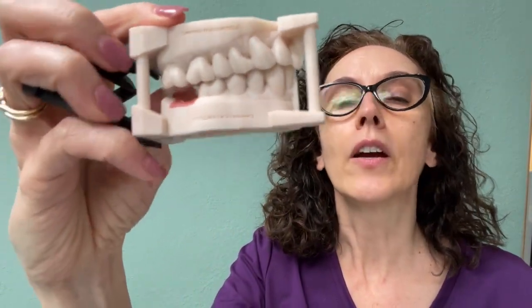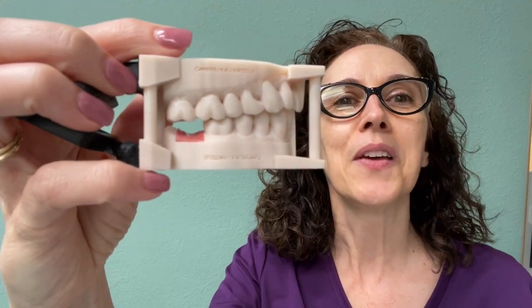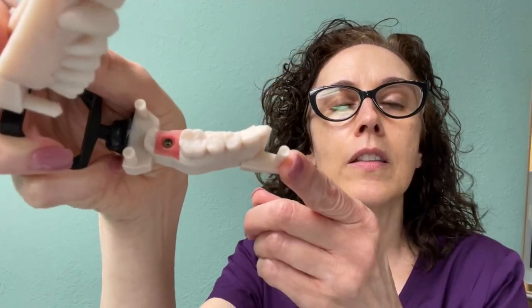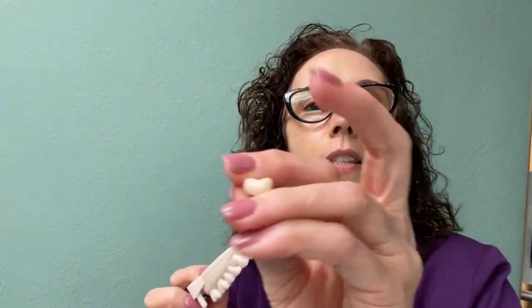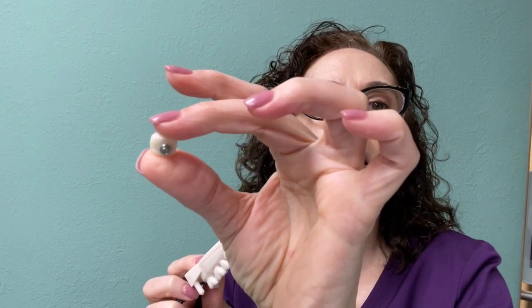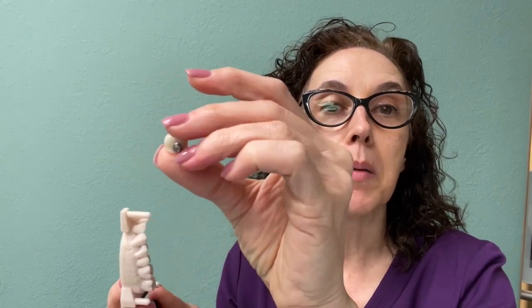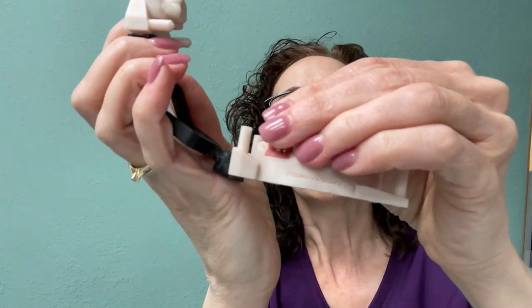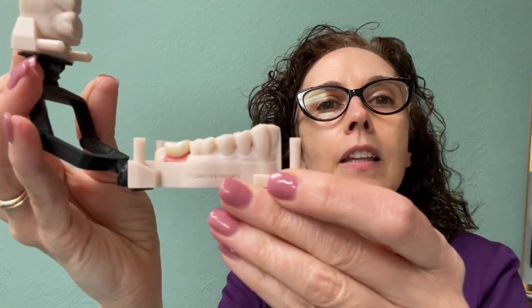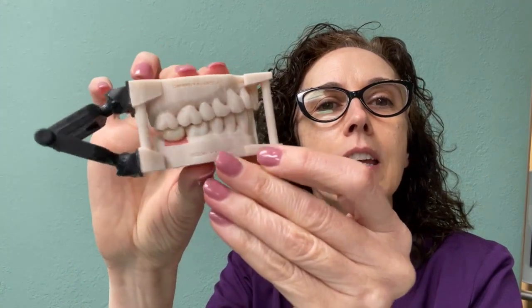So you can see where we're missing that tooth, and where the implant would be down underneath the gum tissue. And then the crown can go into position. So you can see that that's a crown. It has a hole for the screw access. And then it's got this little stub there. And actually we can see right through, can't we? So that is the little part, the custom abutment that's going to go in to the implant there. And it'll seat right down perfectly like so and be right in the appropriate bite. You can see it from all angles. That's how wonderful a model is.